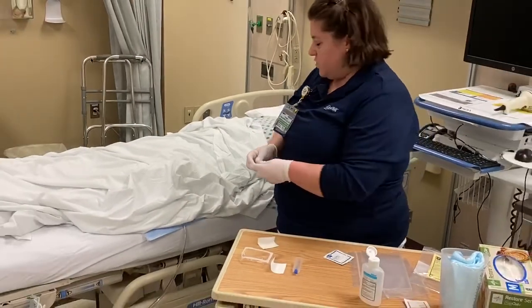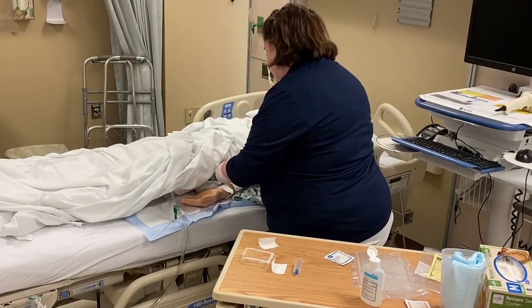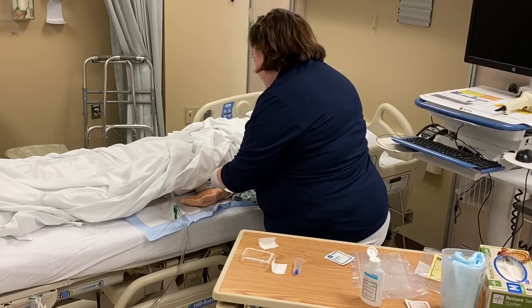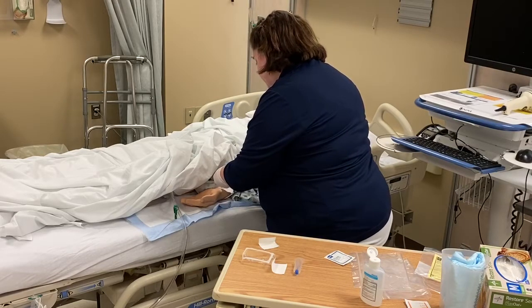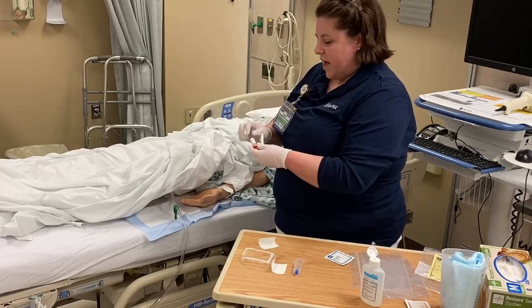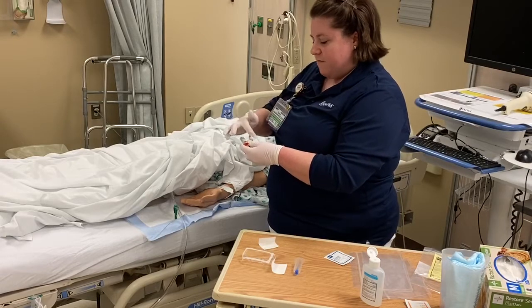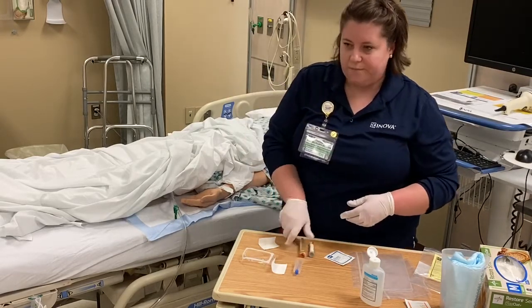I can grab my tubes again and just verify one more time against my patient's bracelet that I have the correct patient, Mir Muhammad. I have the correct MRN, 098-76655. And then I'm verifying one more time. I have my yellow and red label on my yellow and red tube. I have my gray label on my gray tube. So I know I'm good with my labeling.